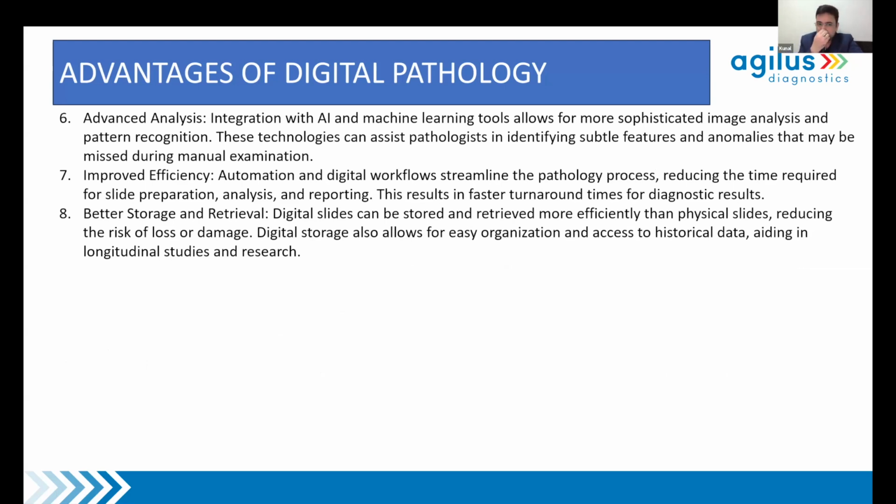Also, there is an improved efficiency because of automation and digital workflows streamlining the pathology process. It reduces the time required for slide preparation, analysis, and reporting. This results in faster turnaround times for diagnostic results. Imagine a situation, especially since we are a reference laboratory, we get a lot of international cases. So you have blocks which are shipped from countries in Africa, Southeast Asia. Now, if you have a scanner there, you can immediately scan those slides and they can be seen by a pathologist sitting here.